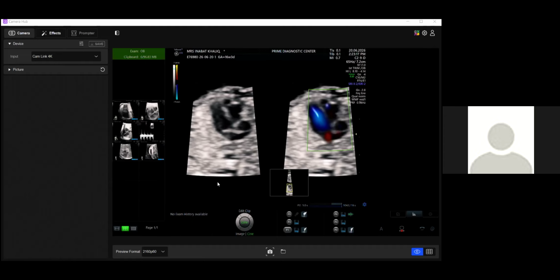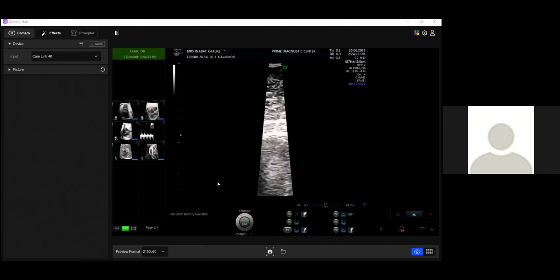SSA, both are there. Okay, so now we should start screening the fetus at 18 weeks and do it two weekly till about 28 weeks. If nothing has happened till 28 weeks, nothing would happen later. That's how, and we do it with the PR interval. So I'll just check the PR interval now and document it, and then we would have to follow up with the PR interval as we go.